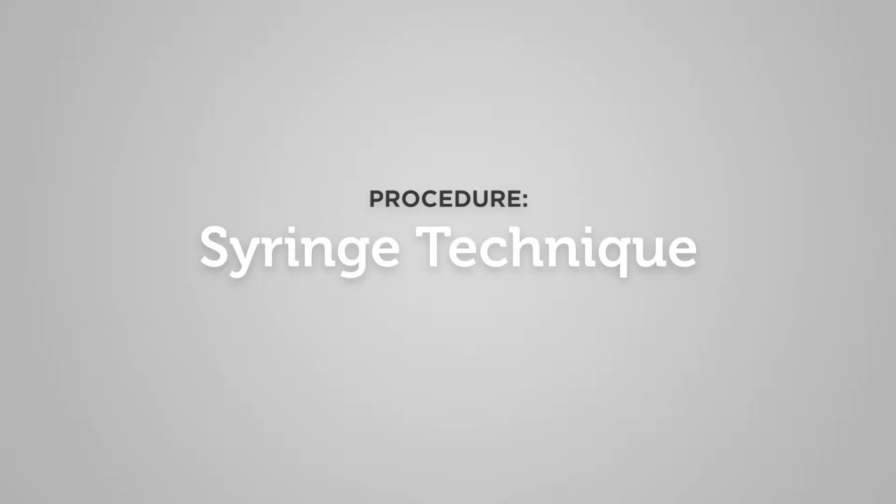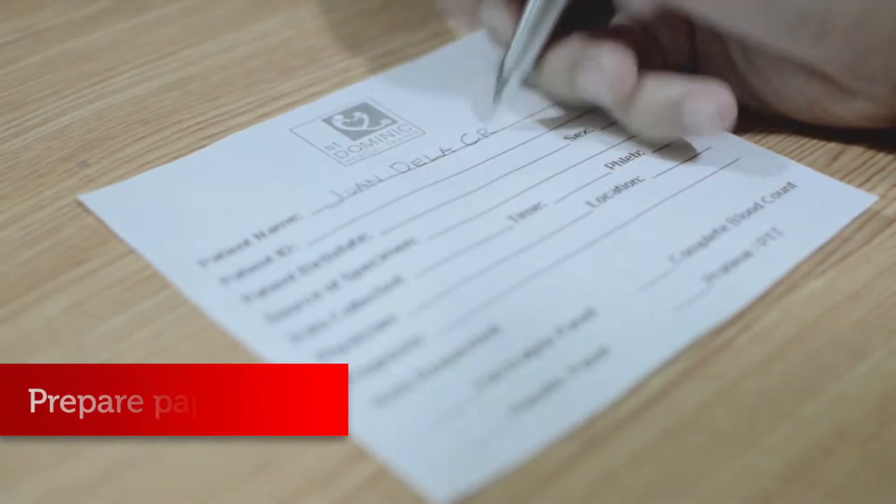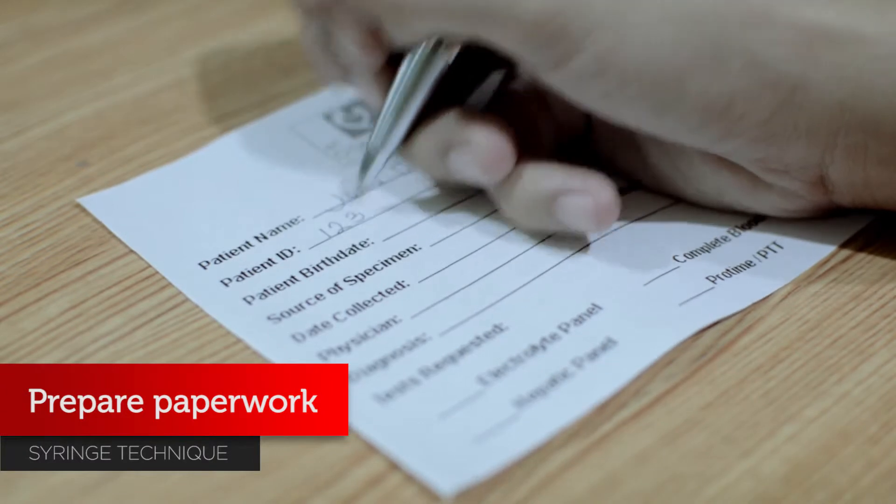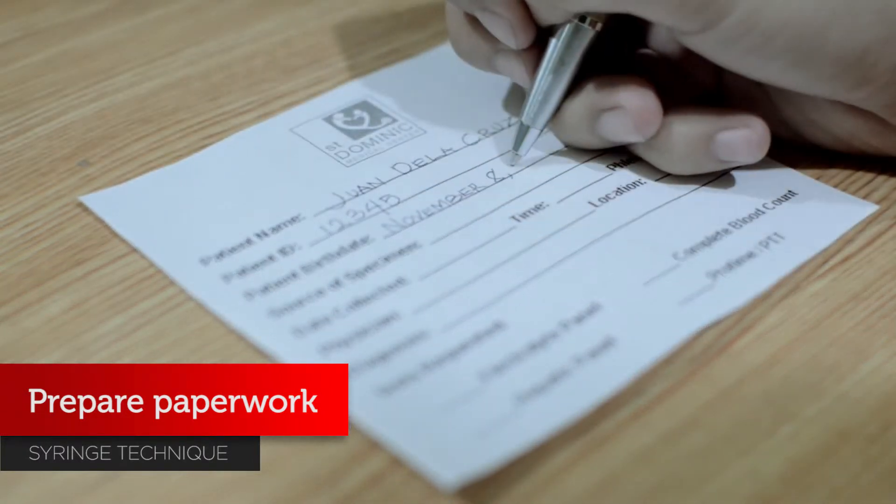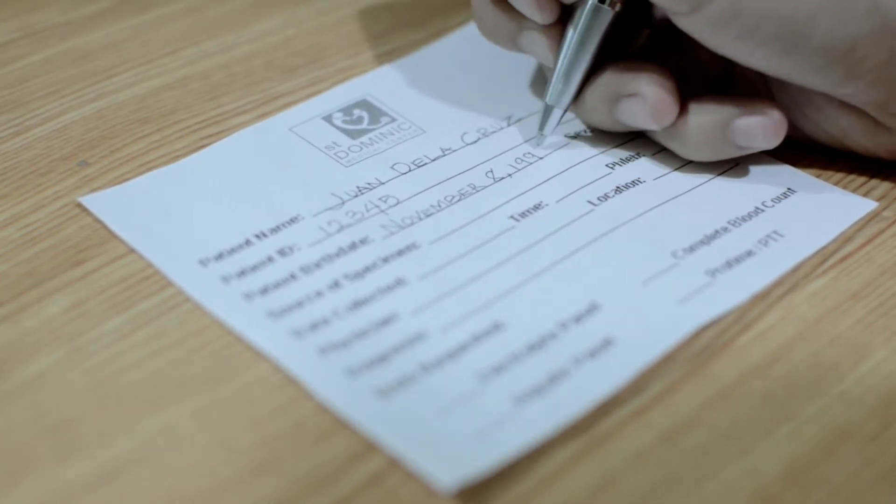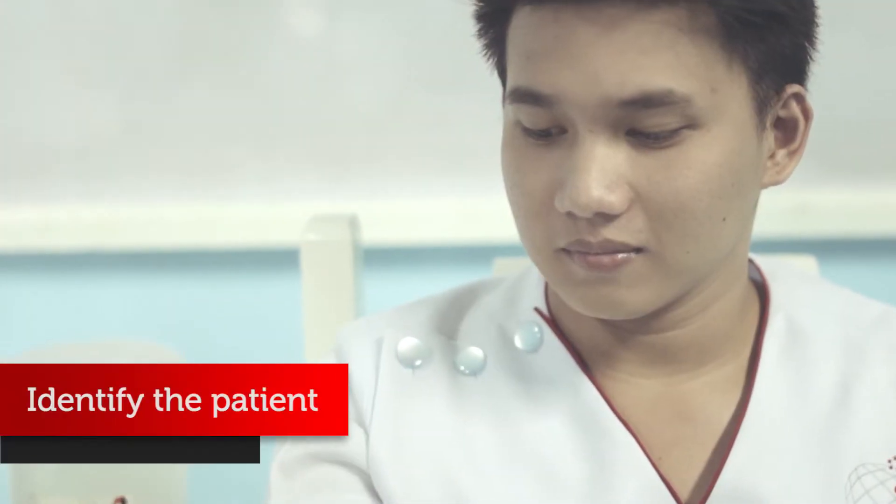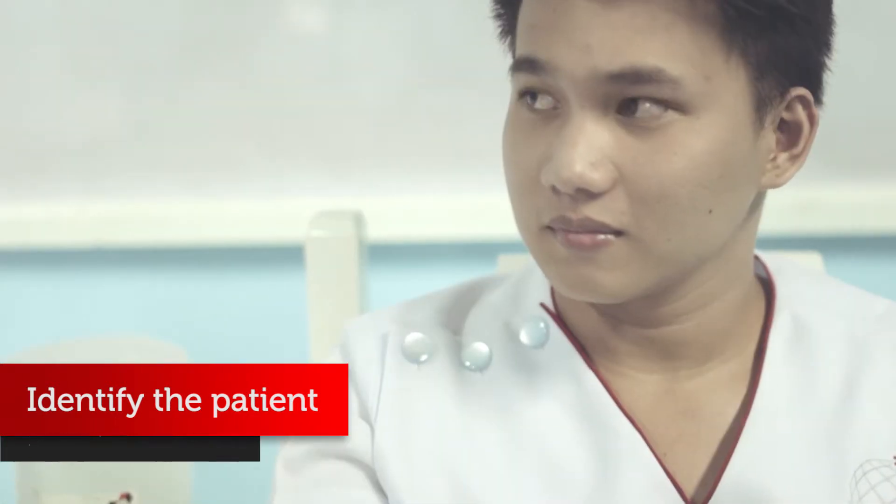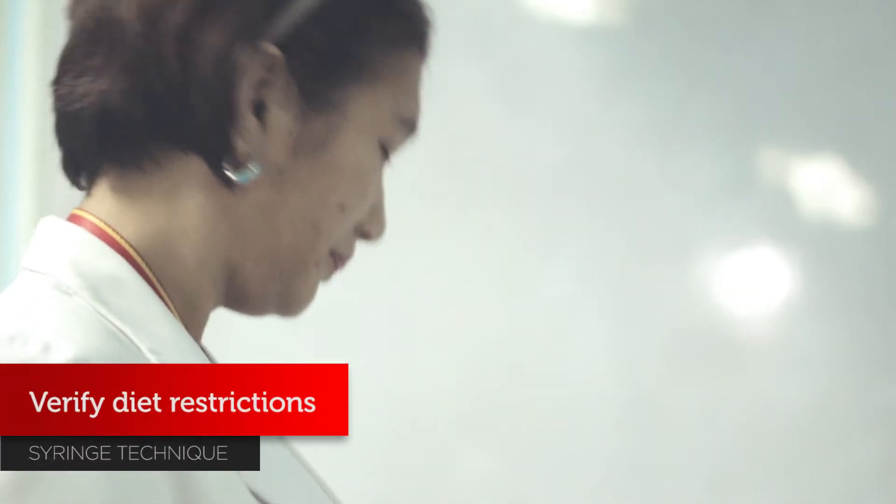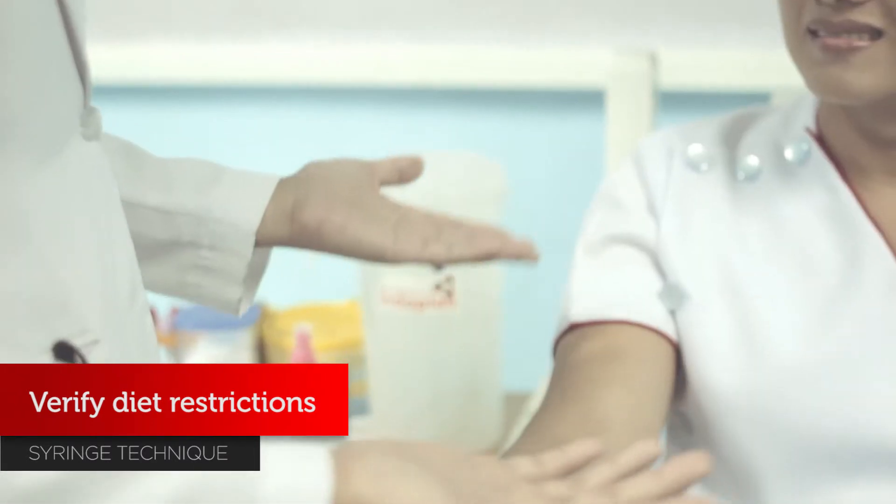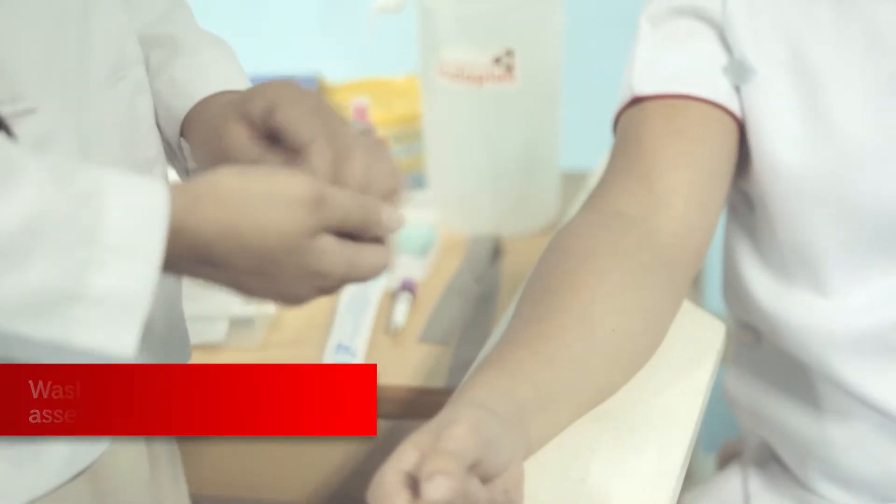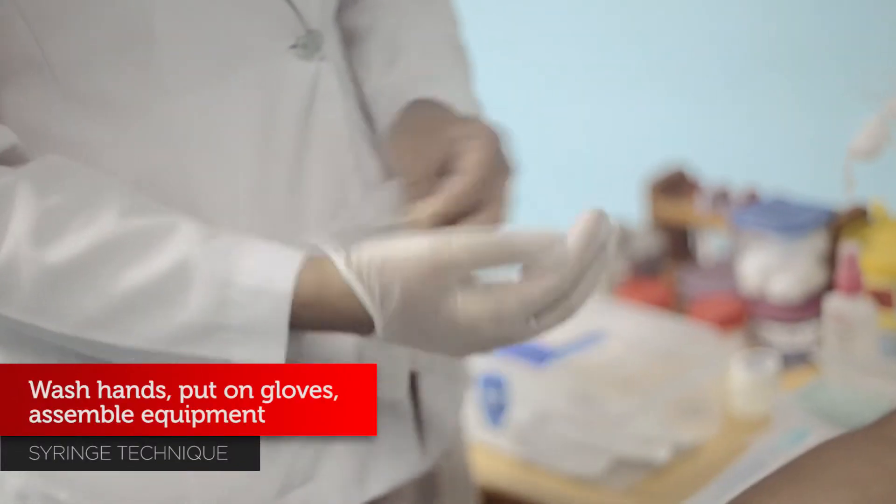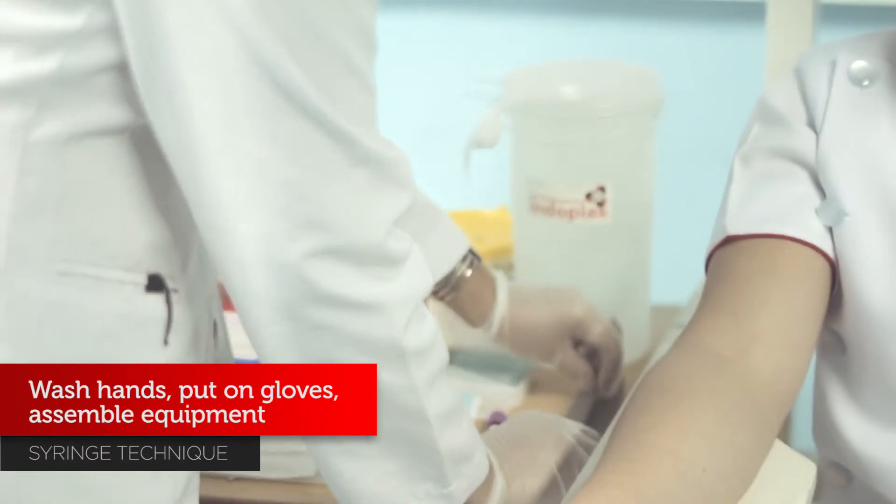Procedures in doing the syringe technique: prepare paperwork, identify the patient, verify diet restrictions, wash hands, put on gloves, and assemble equipment.